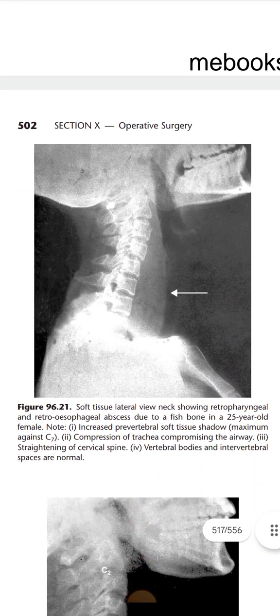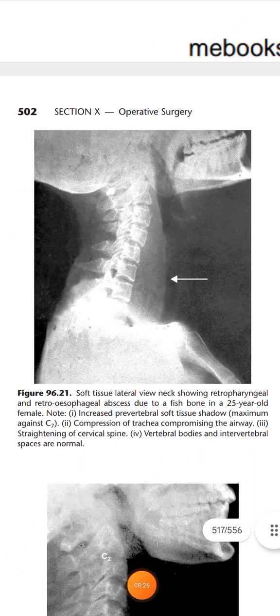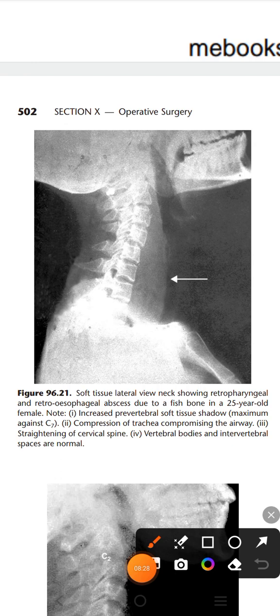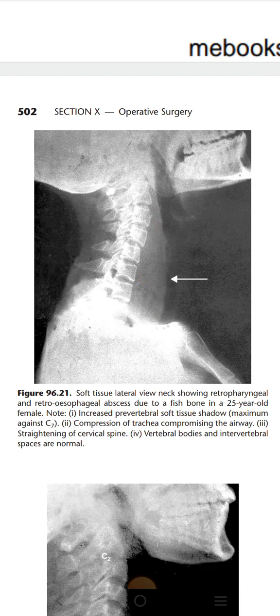Here, if you have seen the previous video, you can clearly appreciate that the pre-vertebral shadow width has increased — much more than the width of the vertebral body. This is a case of retropharyngeal abscess or acute infection of the retropharyngeal space, which can be seen clearly here.